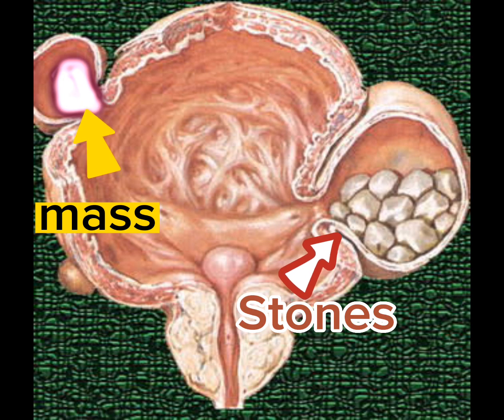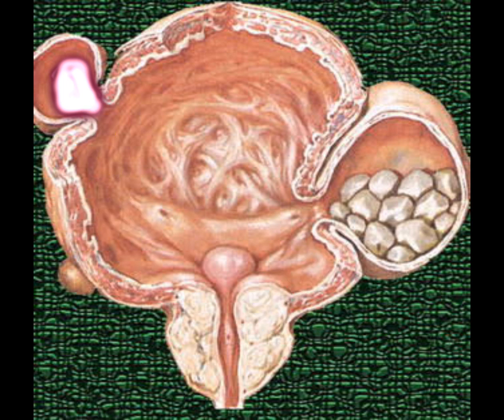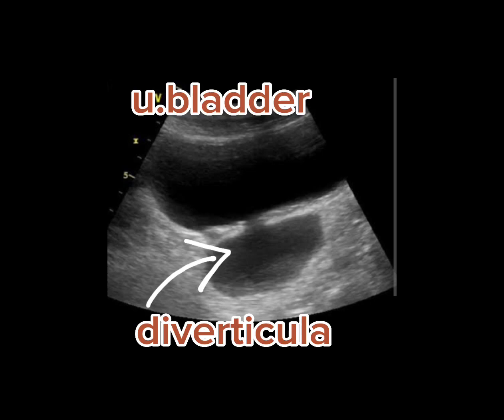Here we can see a summary of two main complications: multiple stones in the diverticula, and evidence of growth in the diverticula. This is an example of ultrasound where we can see the urinary bladder with a single diverticula and a small opening communicating the diverticula with the bladder.